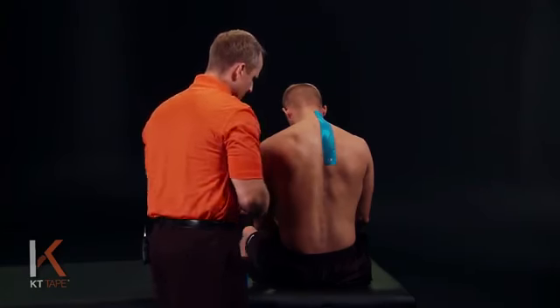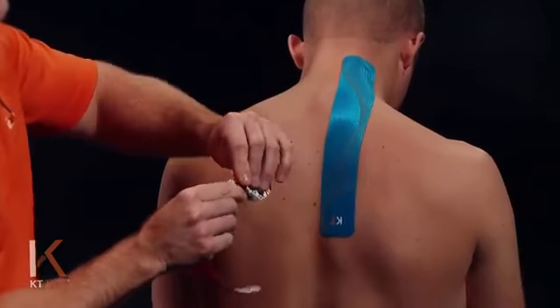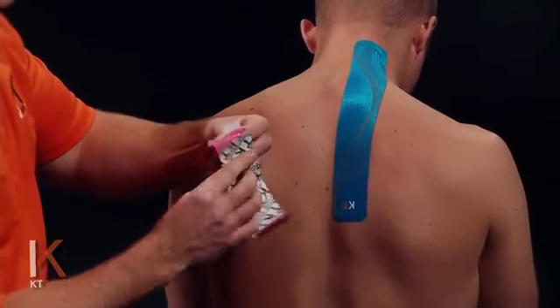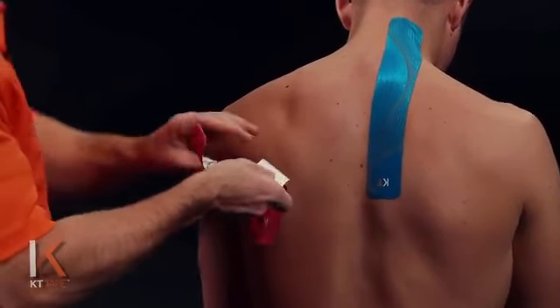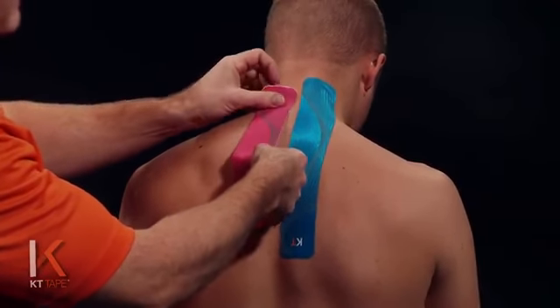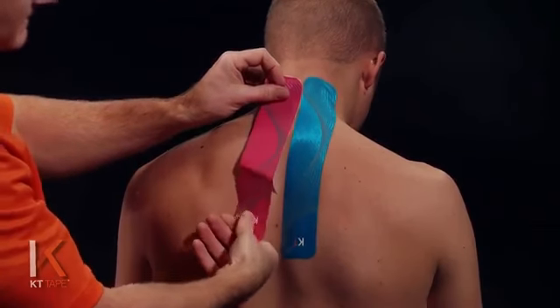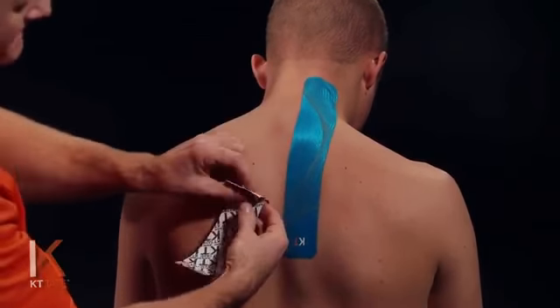Okay, for the next piece, just like the first one, I'm going to twist and tear the backing paper down near one end of the tape and remove that. Okay, I'm going to measure as I did with the first one, so that ends up about the same place as that first strip.